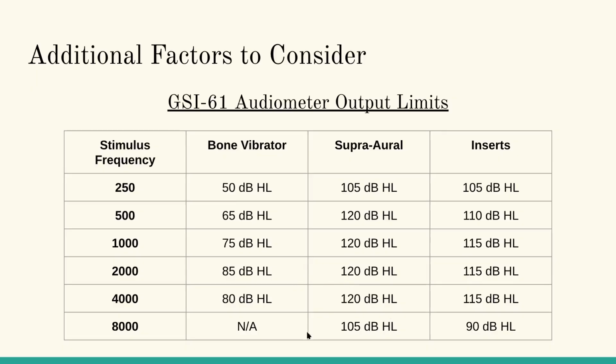The biggest thing that you notice is the bone conduction vibrator output is way lower. But remember, we also have vibrotactile thresholds to contend with at low frequencies. So at 250 hertz, a lot of times these patients at 50 dB are feeling the response rather than hearing the response.